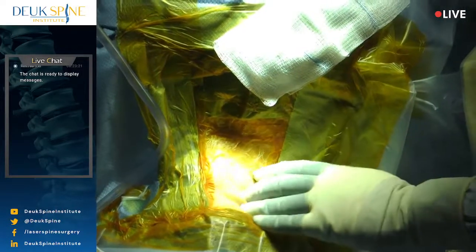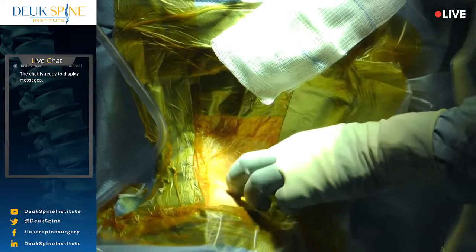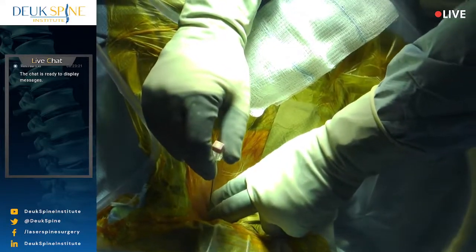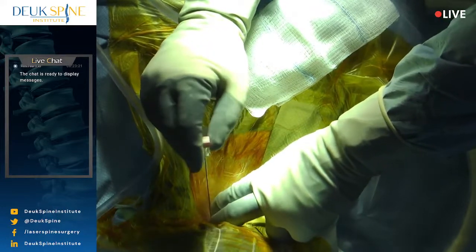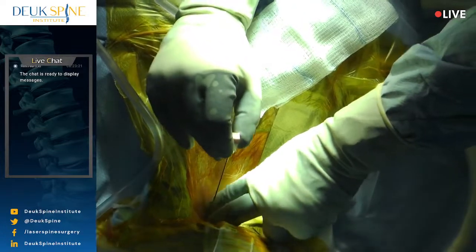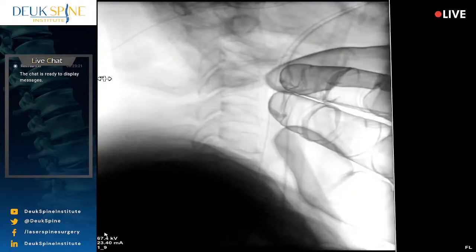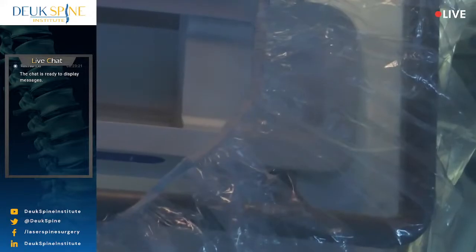Yeah. All right, so I'm gonna have to be a bit higher. And we have the esophageal temp probe in. Let's see where that is. Shot. That's better. That's much closer. 2, 3, 4. We're almost there. And let me see where my needle is. That looks good. And shot. Give me an AP. Shot. First lateral, then AP. Quick. We're right there. Quick, quick, quick. Right now. Quick shot. I just want to see how close I am.